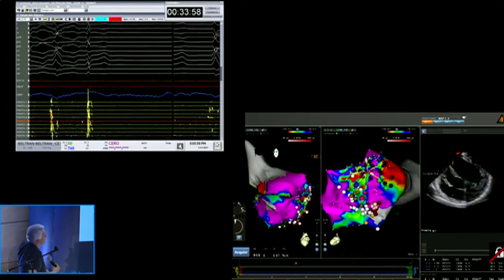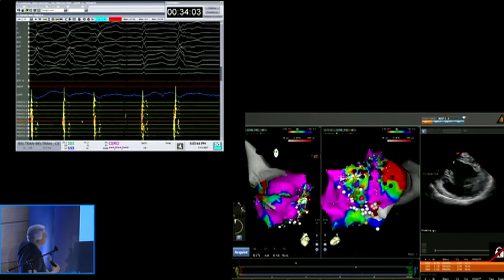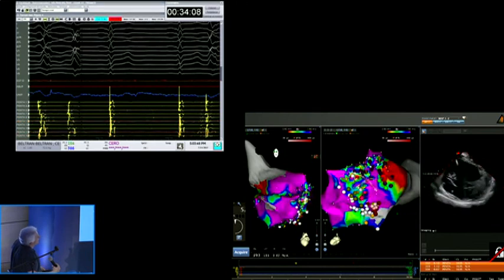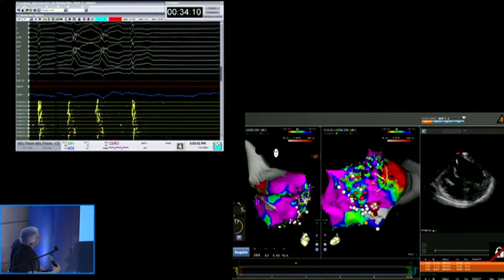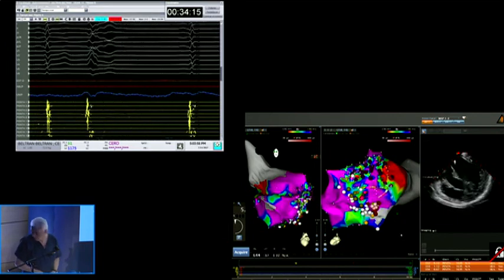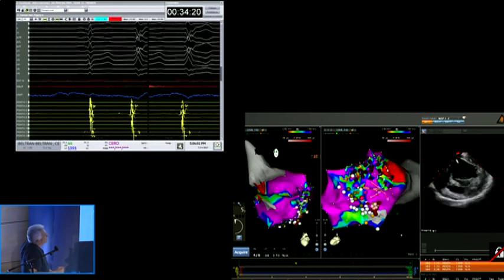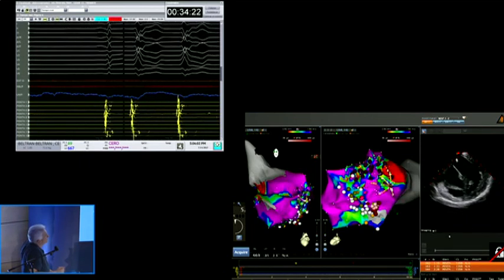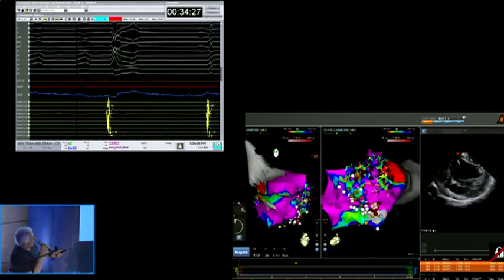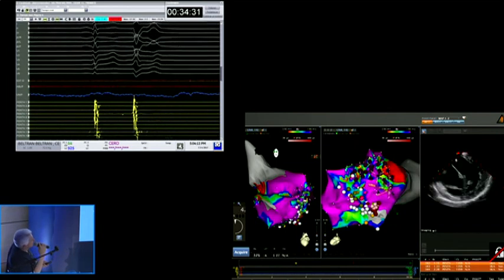Ahí pasaste. Ya lo tenemos, esto ya toma voltaje ahí y marca los LED que veas. Todos, de hecho, tienen LED. Aquí más. Agarra estos también. Sí, hay uno super late que es el 17. En el canal 17 se ve algo bien tardío. Pero mira la mesa, sí, curioso. El voltaje, la amplitud no es particularmente baja.